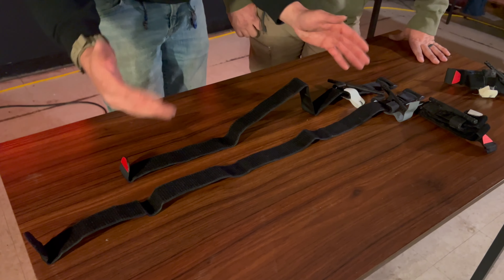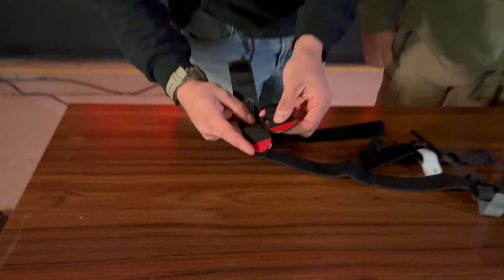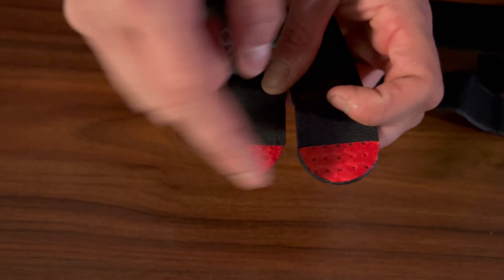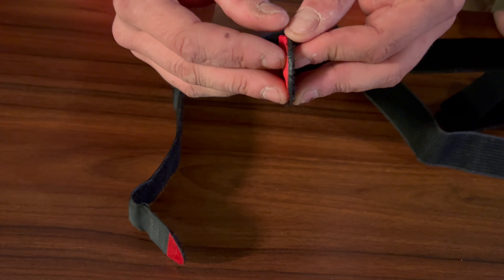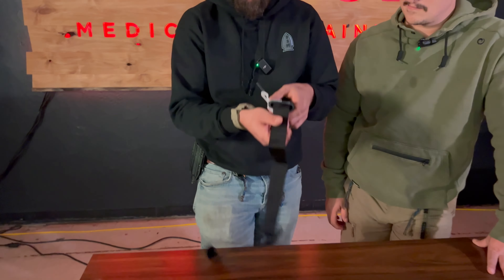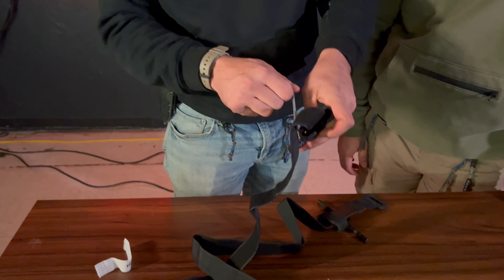We'll lay it out right next to the CAT so you can get a look. First things first, you can look at the length — the CAT is exponentially longer, which allows you to use it on a bigger limb with a bigger circumference. On the fake, they just kind of stamp through with heat glue right here, whereas on the CAT they heat glue and lay it down properly, so the fake can fall apart pretty easily.